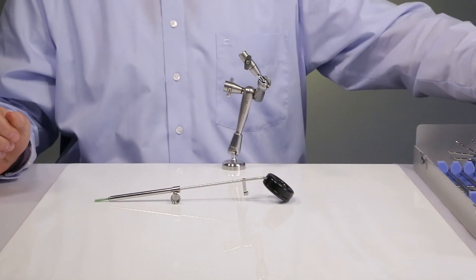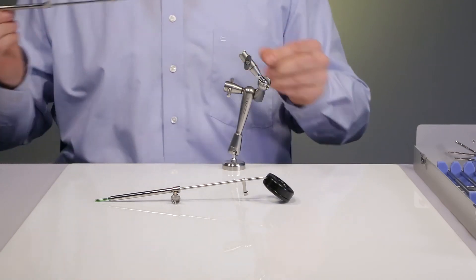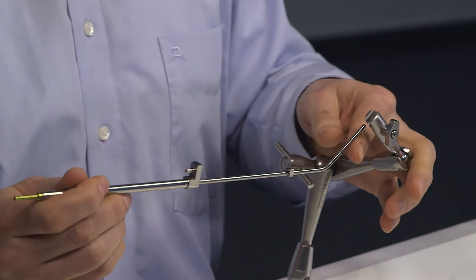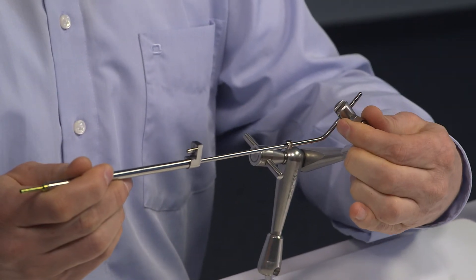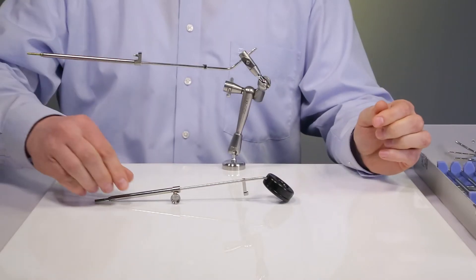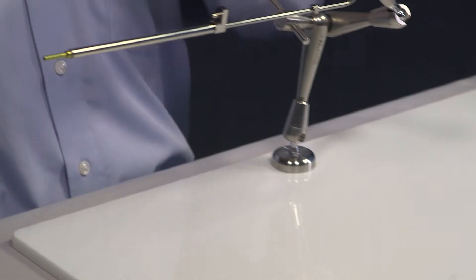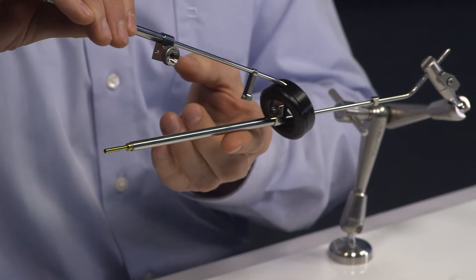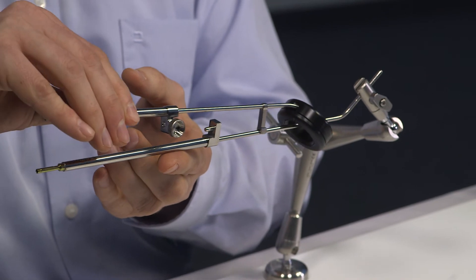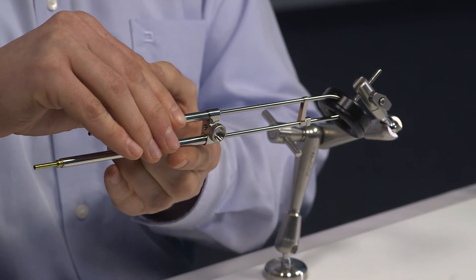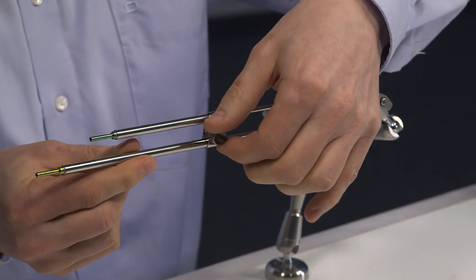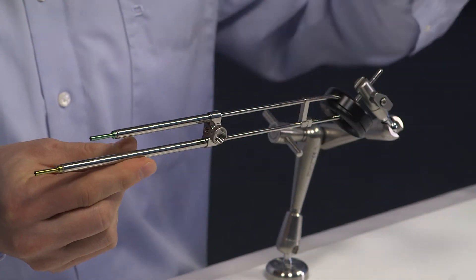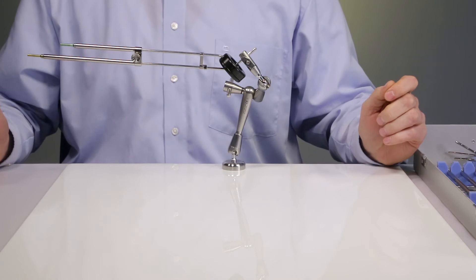I now select the intrauterine tube and simulate the insertion. The ring applicator is now guided over the IU tube and fixed into position with the side screw. Now the assembly is complete.